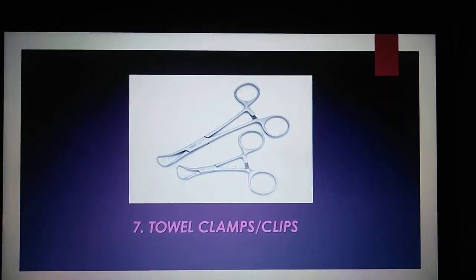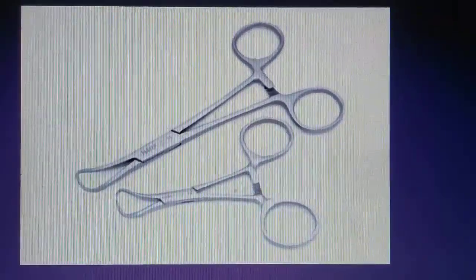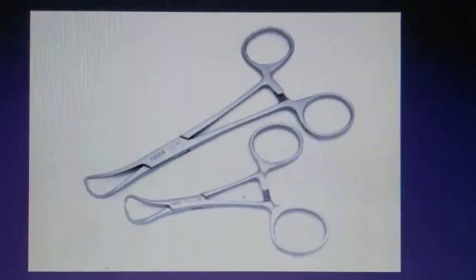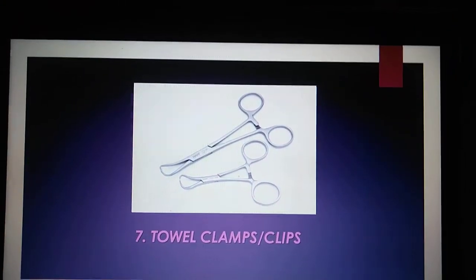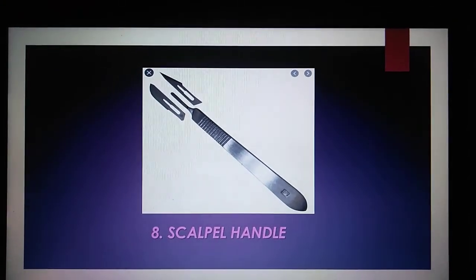Towel clamps are used to fasten drapes or towels to patients during medical procedures in order for them to stay in place. Scalpel handles are used to hold the scalpel blade.